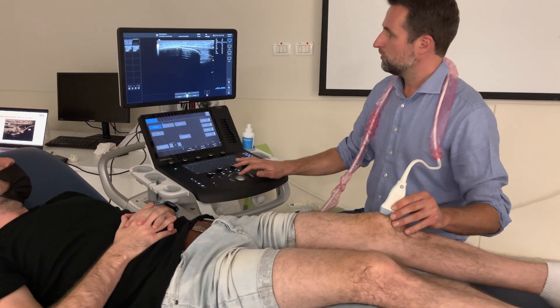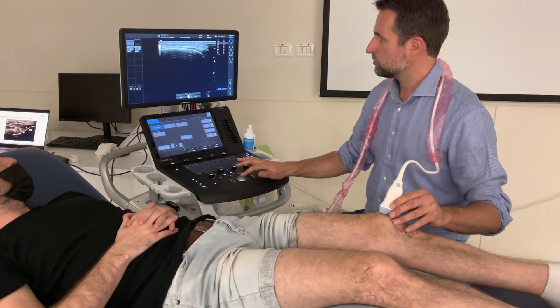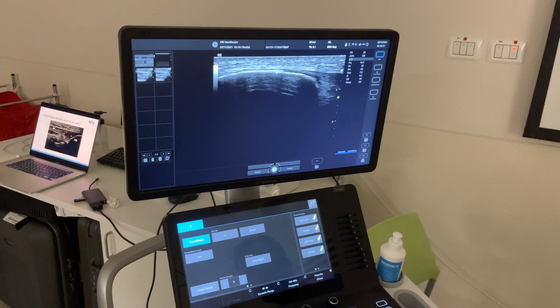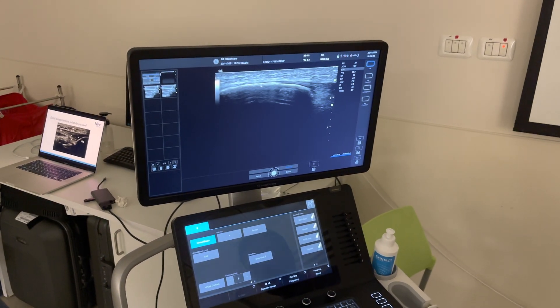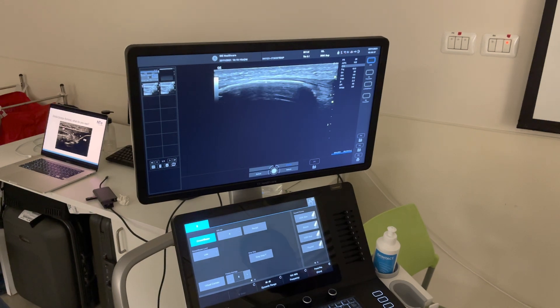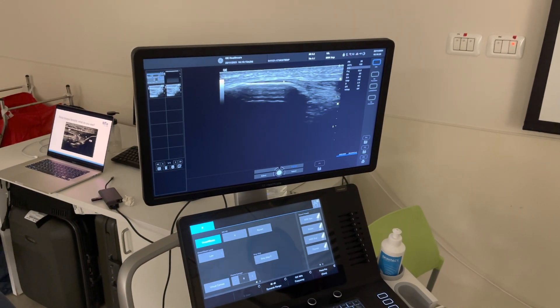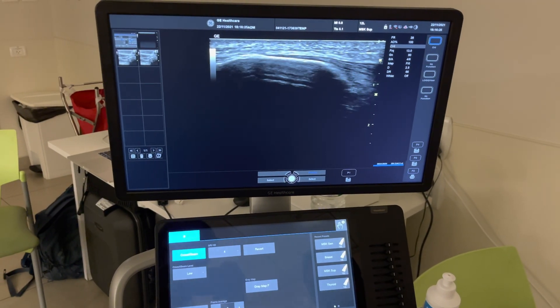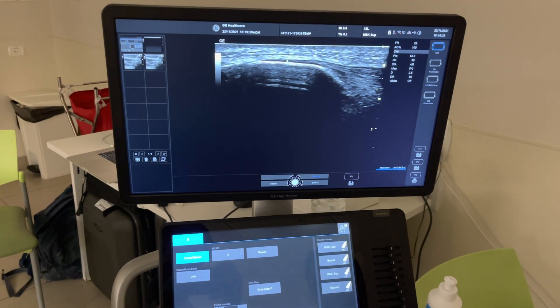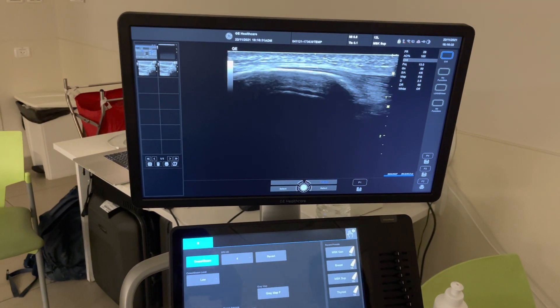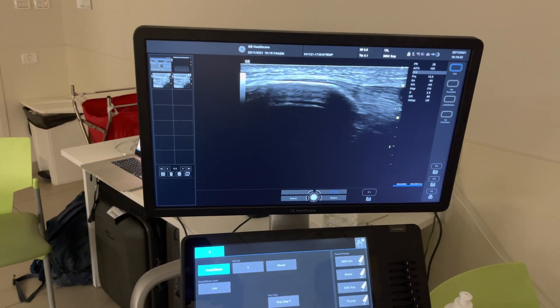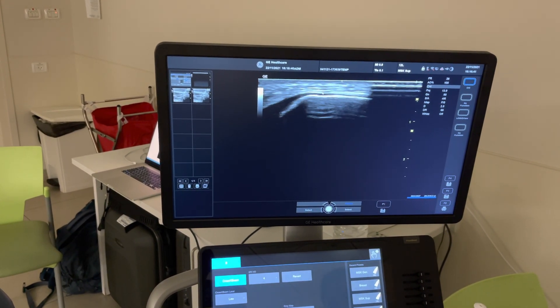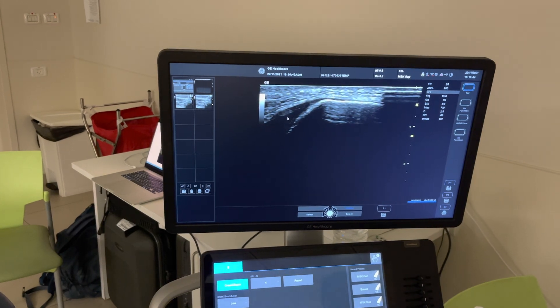Going a bit further, we're on top of the patella right now. We see a very nice bone line of the patella — no strange structures. People who do contact sports or rugby sometimes have very strange bone lines here, but in this case it's quite a normal line. We see the patellar tendon going over and stopping quite far on the patella, and superficial to this layer we see a hyperechoic layer that is continuous with the peritone.